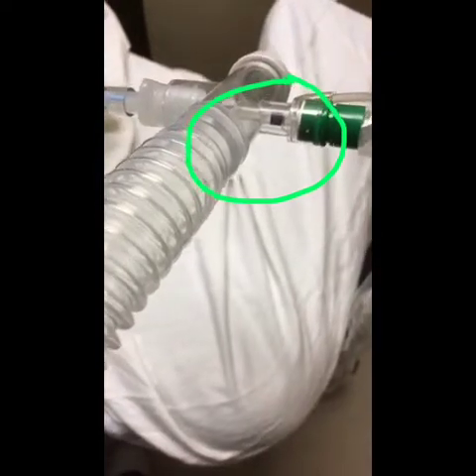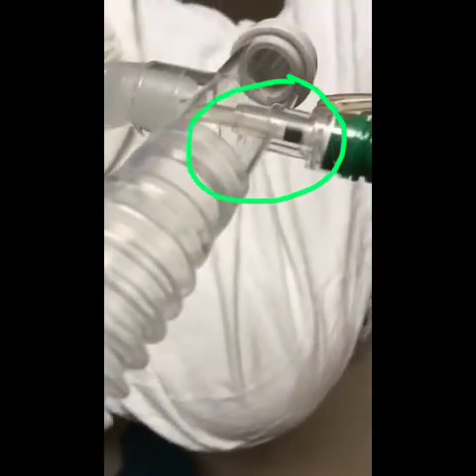When you finish suctioning, always be sure that the black indicator is located in this window. Remember that when you suction a patient, pushing that catheter into the ET tube reduces the diameter of the airway by half. To compensate for the reduction in the airway size, the patient's work of breathing has to increase 16-fold. Always be sure before leaving a patient's room that the suction catheter is pulled all the way back out.